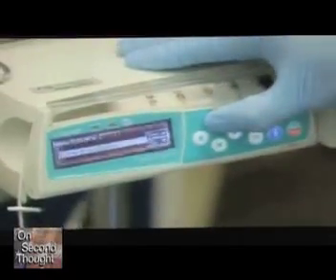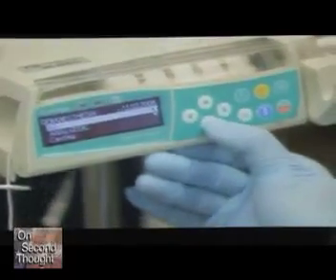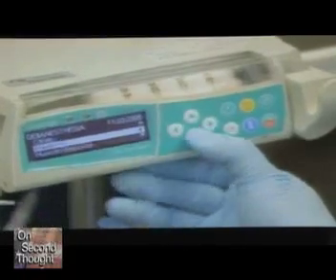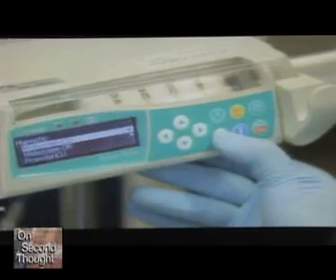Now he's going to program the pump. And so he goes down here and he's going to select the kind of drug he needs. I can see the word analgesic. I don't think that's what he's going to use. He moves past cardiac, past other to hypnotic. Propofol is considered a hypnotic, so that is selected.